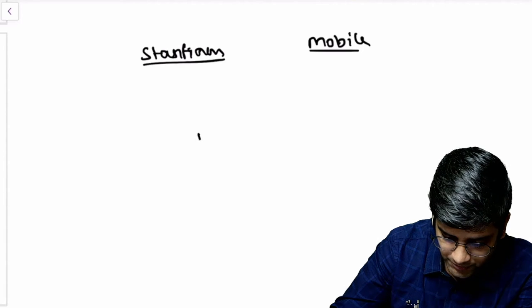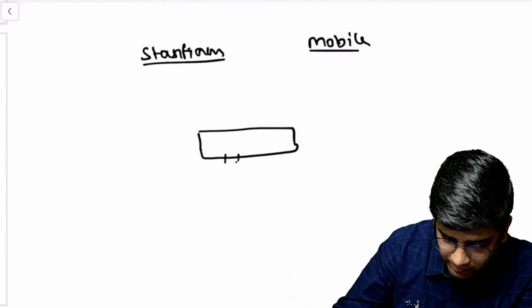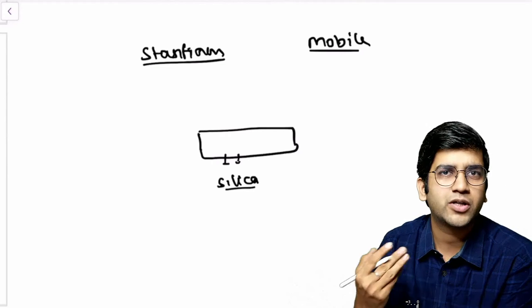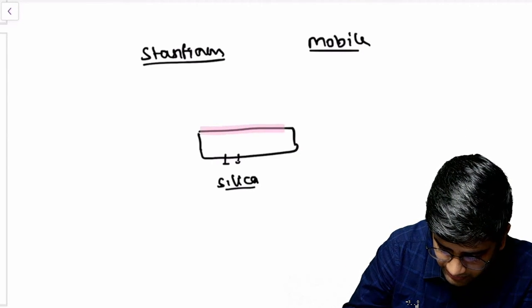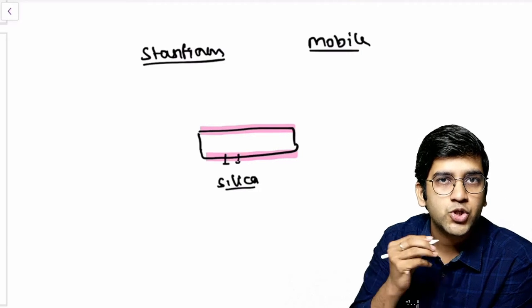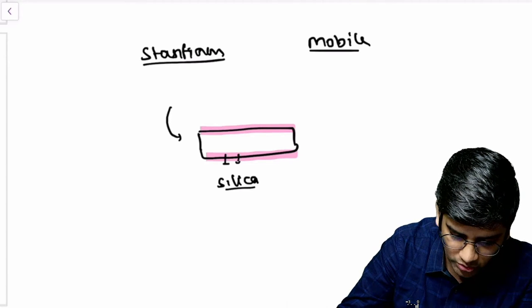So in the cartridge, what we have is, it'll be coated by silica. It'll have a silica coating on the side, along with the carboxy terminals, it'll be coated there, right? Let's assume this cartridge has been coated by silica, okay? It has the negative charge. So when I put the sample inside, that's the first stationary phase, the sample goes inside.